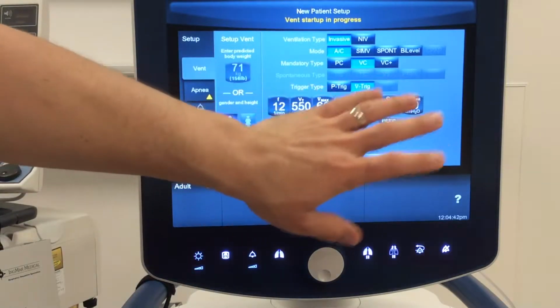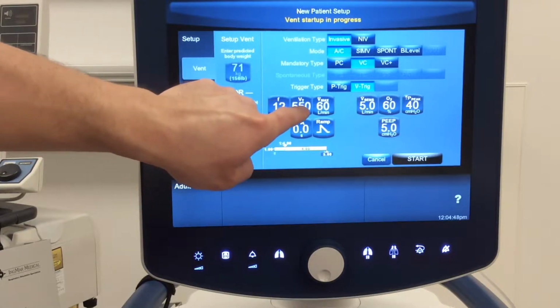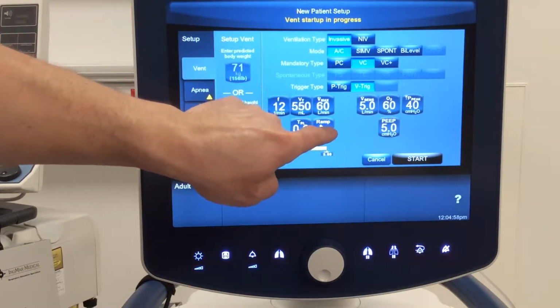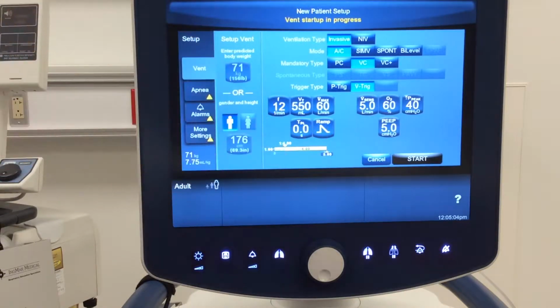So as of right now, our core settings are in. We are going to give 12 breaths a minute, 12 mandatory breaths. Those breaths are going to be 550 mils. All right, that flow rate that we're reaching that 550, the peak flow is going to be 60. We're delivering that in a decelerating fashion, or this ramp flow wave pattern. Okay, it's going to result in a 1 second I time, which is normal. Most of our patients, we got a 0.8 to 1 second I time.